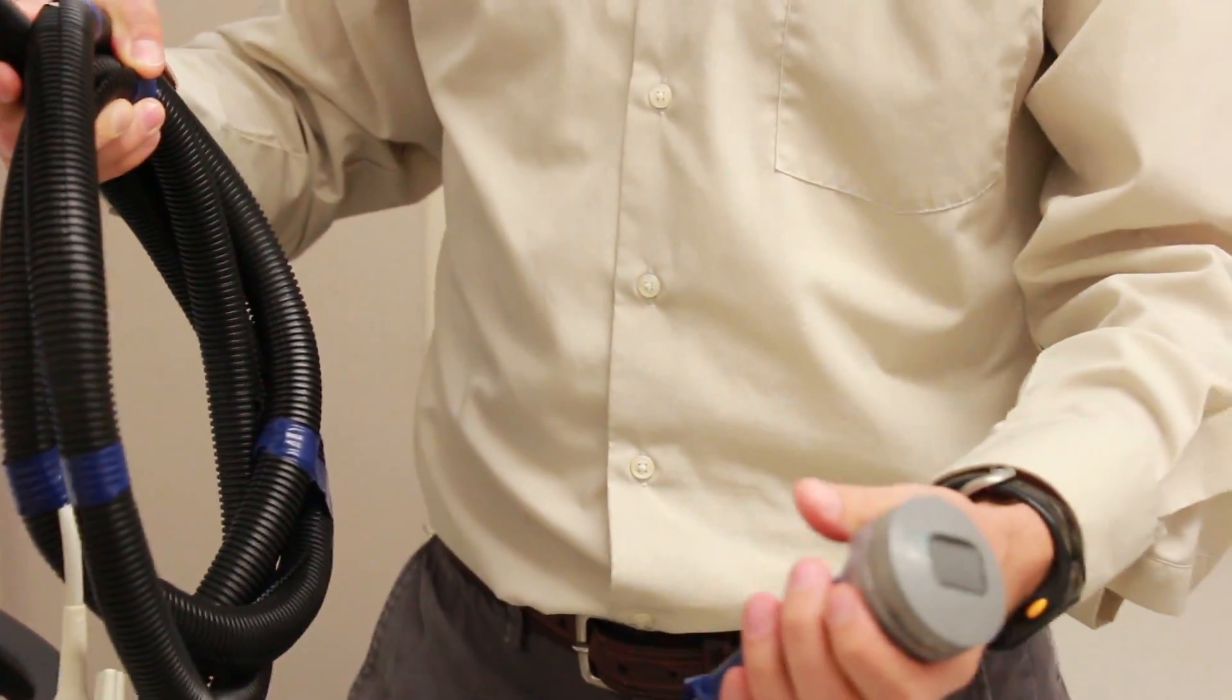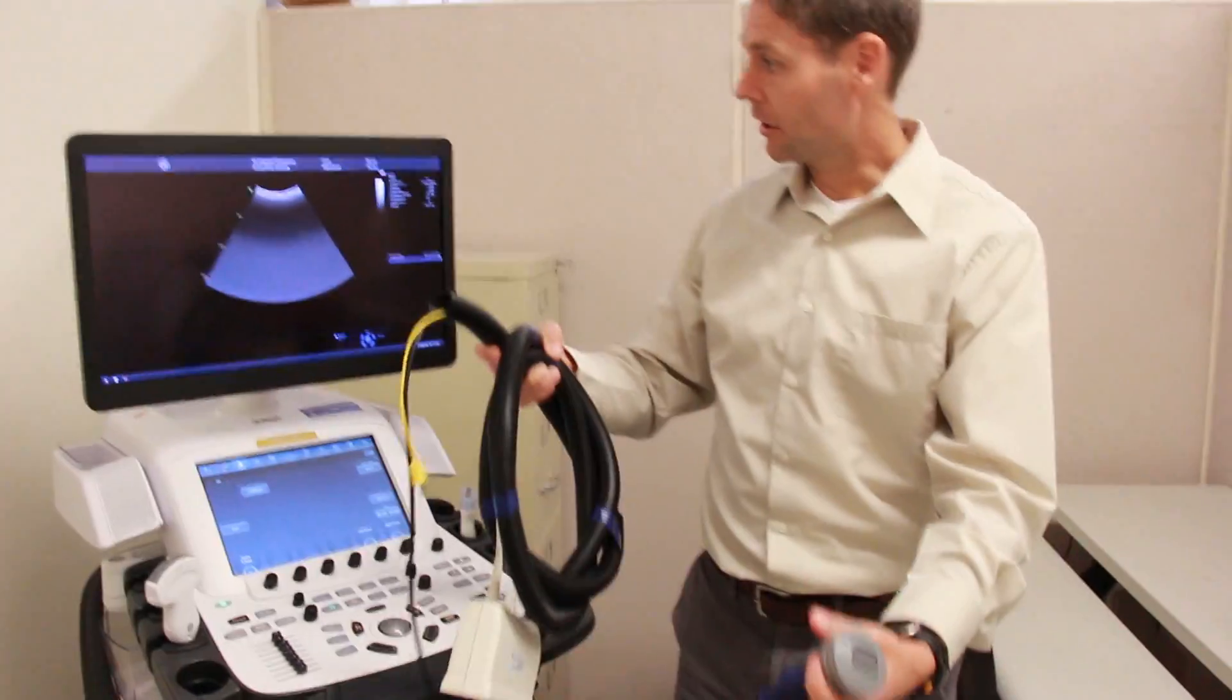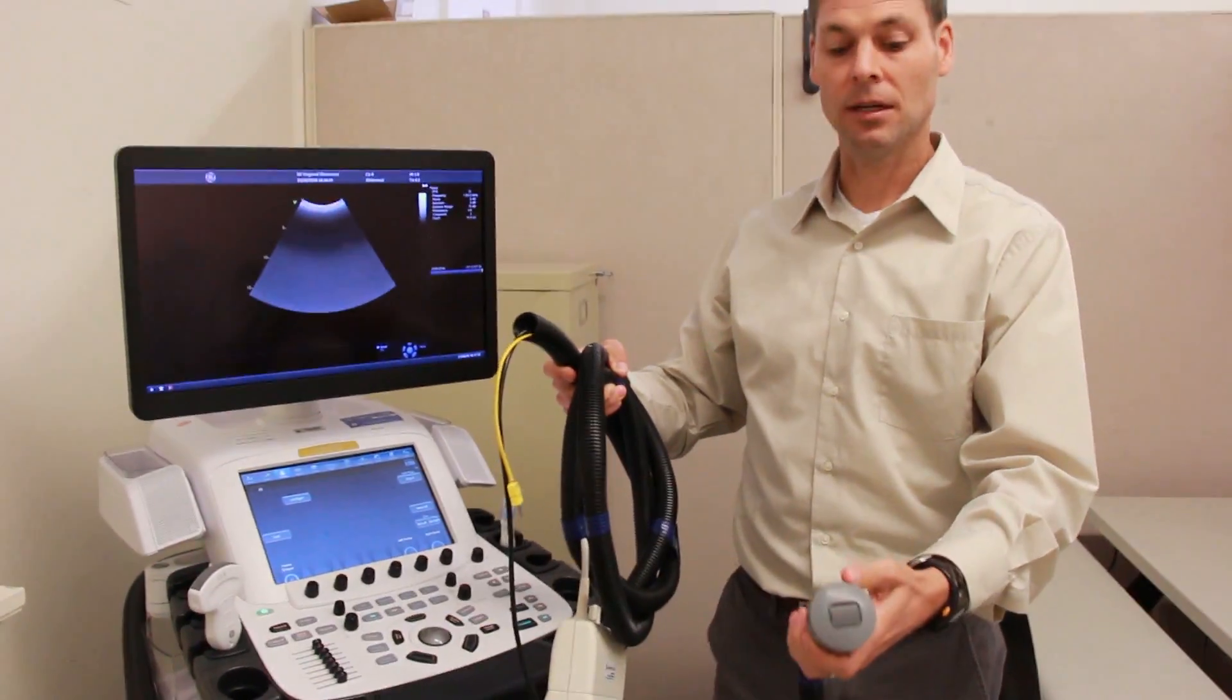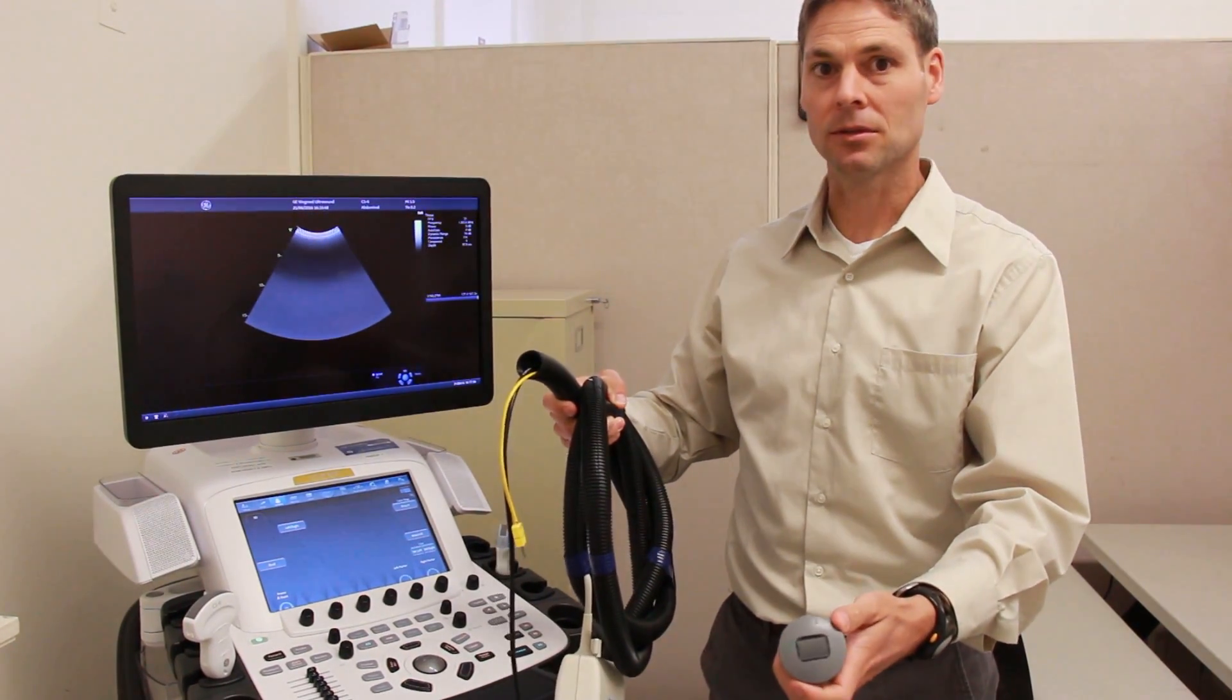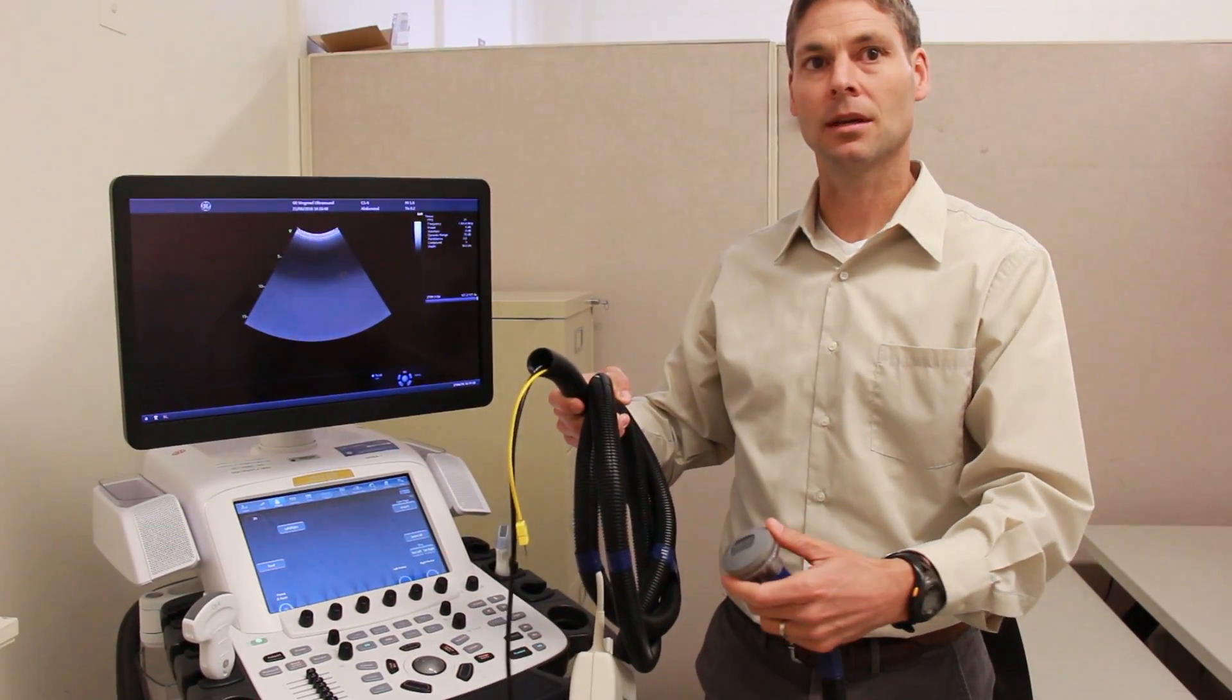With this capability, it's a standard ultrasound imager for all imaging, can image kidney stones, can break those stones, and then push the stones out of the kidney.